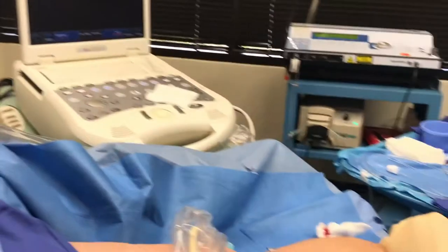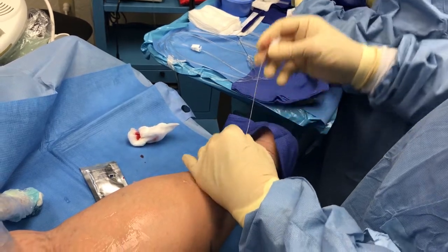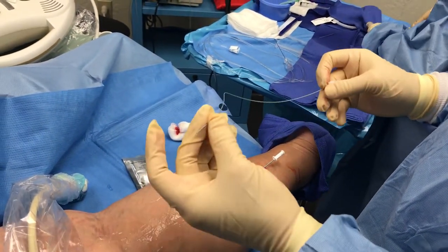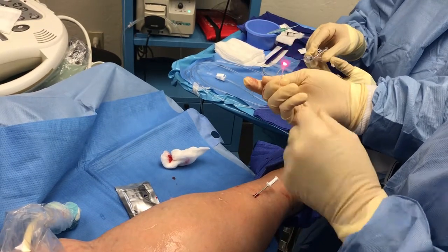The wire is yours. Take the wire out first, unscrew this little piece, and here's the obturator. It's inside the middle — this is about a two French, three French. And then this is the laser fiber.